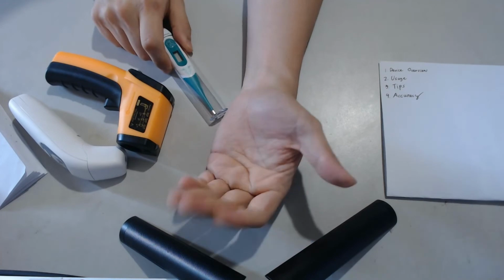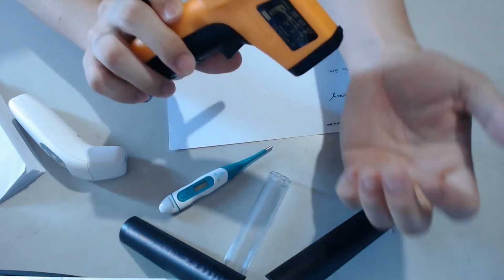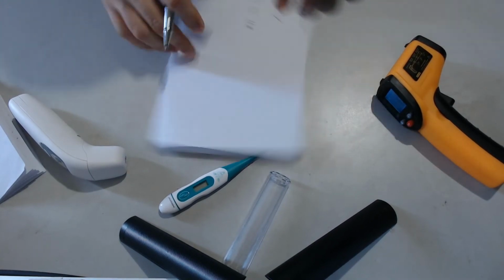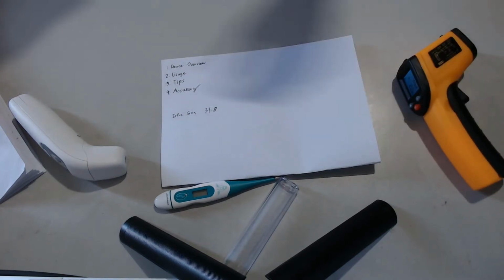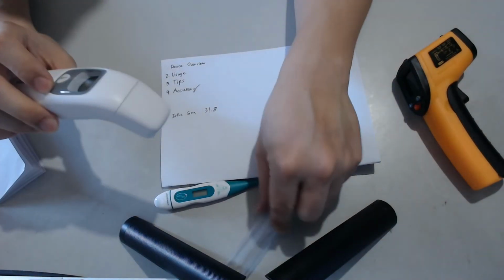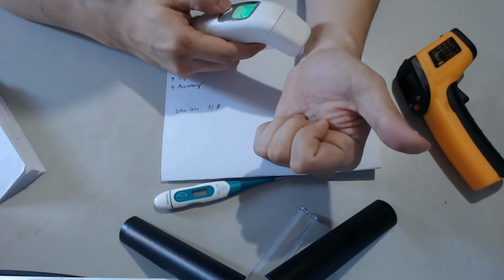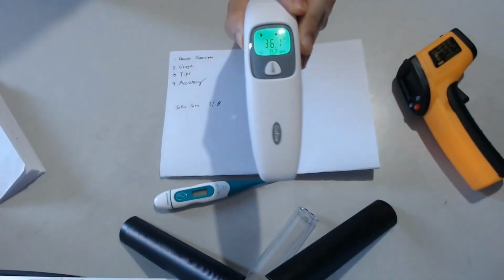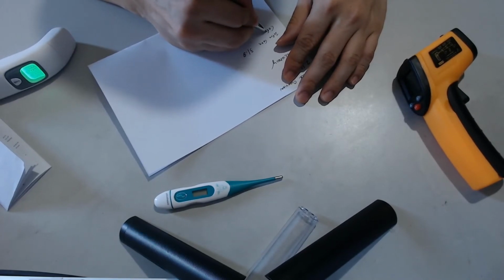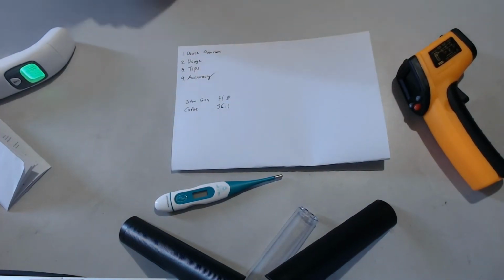and this. Now, this is going to be tricky, so I will have to hold it more. 31.8. So the infrared gun is 31.8. Now for this one, it's supposed to be in the forehead, but again, point is you have to use it where it is, but this is an approximate way of doing it. 36.1. This temperature, 36.1, is more believable than 31.8.